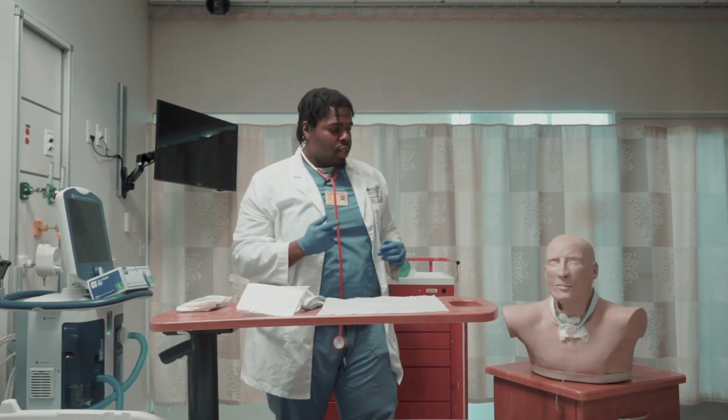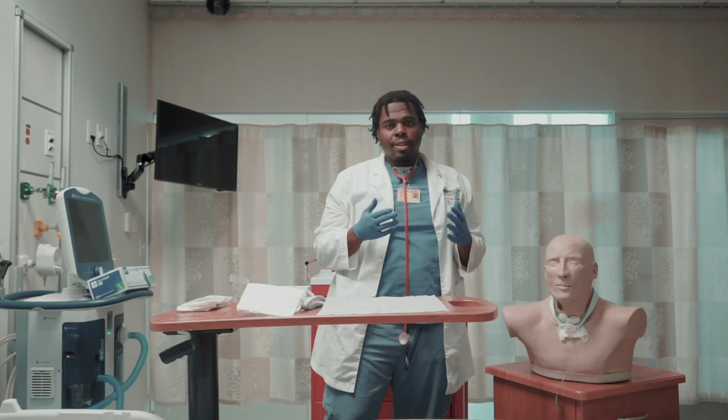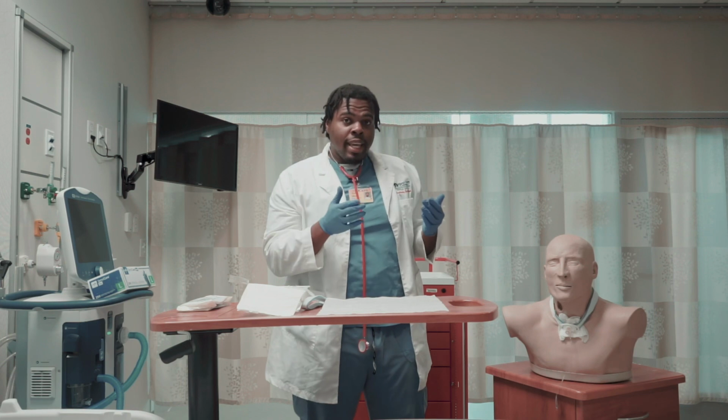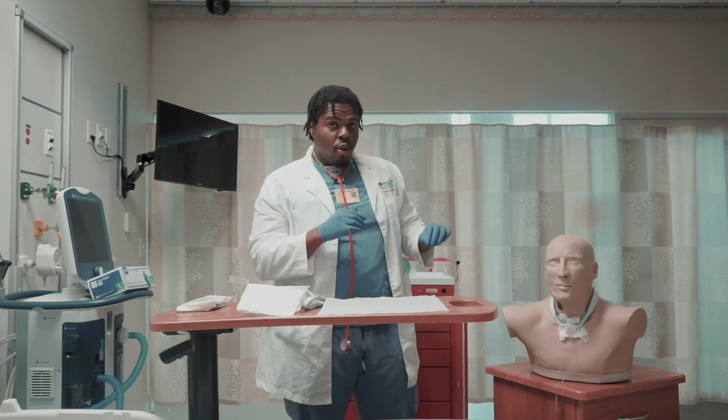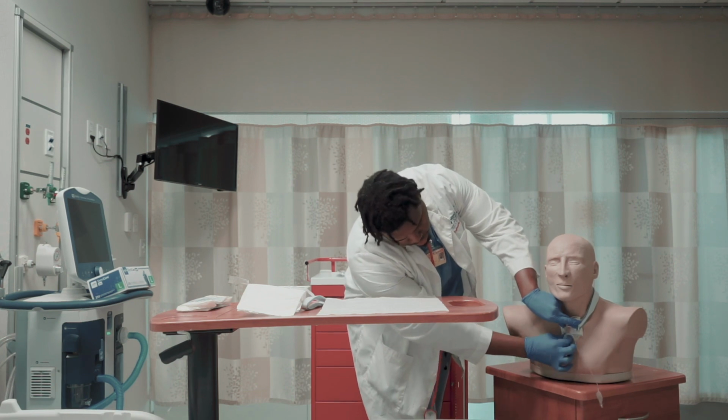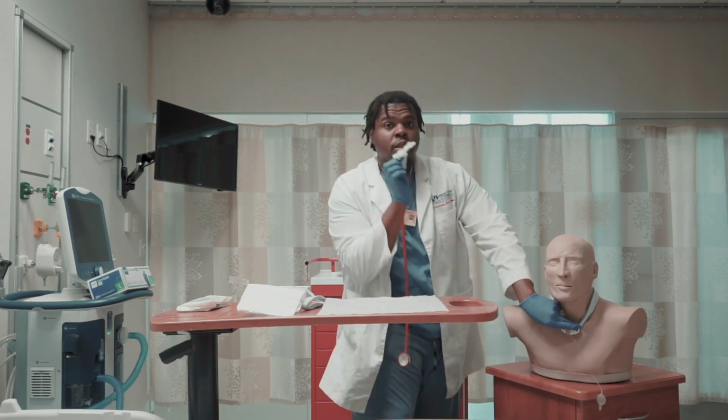Now I'm going to remove his dressing. When removing the dressing or doing anything towards the trach where you have to touch it, decannulation is a hazard, so you want to hold down the flange. You're going to remove his dressing and throw it in the garbage.